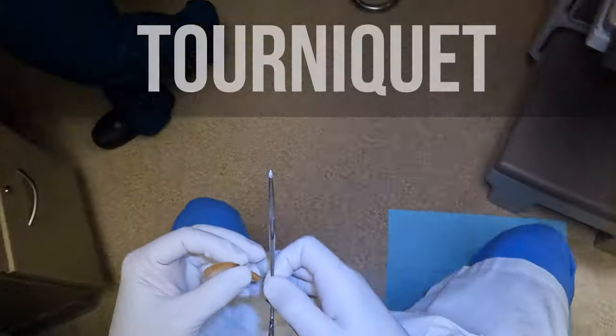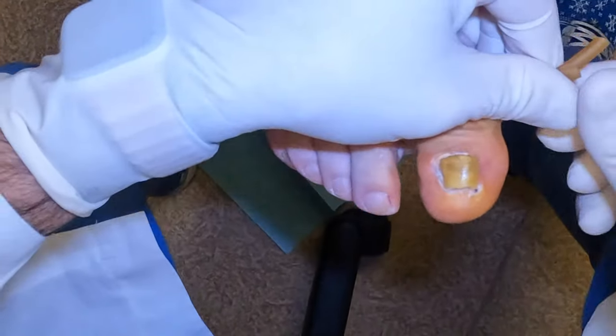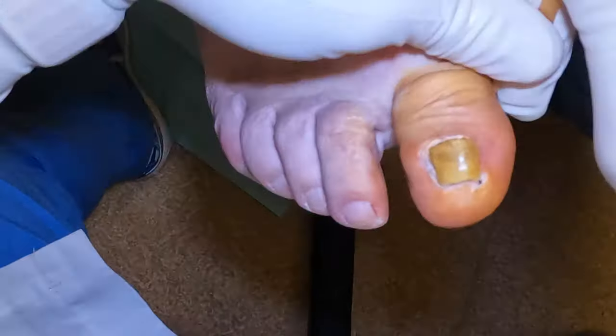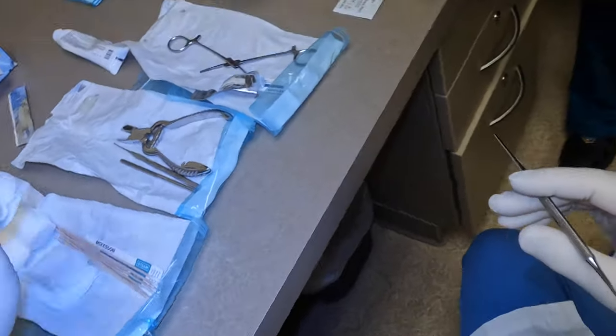He wanted to permanently remove it, so first we put a tourniquet on the toe. This is a penrose drain, and it is something that we use in general surgery or even foot and ankle surgery to drain bleeding afterwards, but we're using it to control the bleeding as we do the procedure.